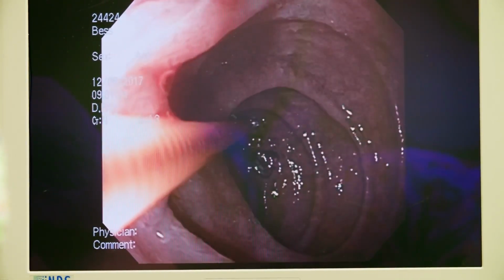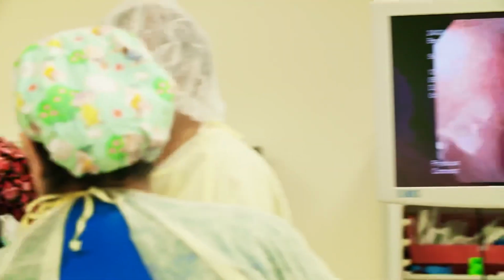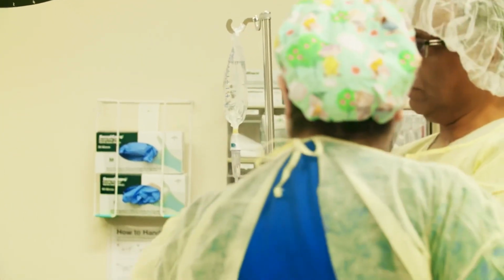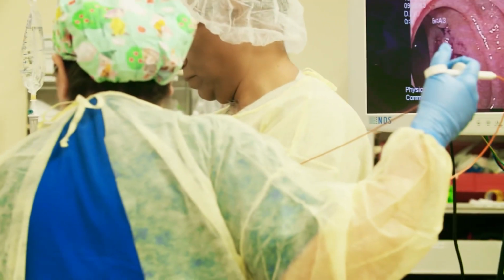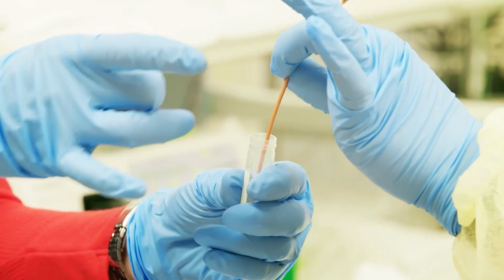Open, close. So before you take the biopsies, you want to make sure you have your specimen container, like an Eppendorf tube, and then you also want to have some ice so that once it's taken, you can keep it in ice.